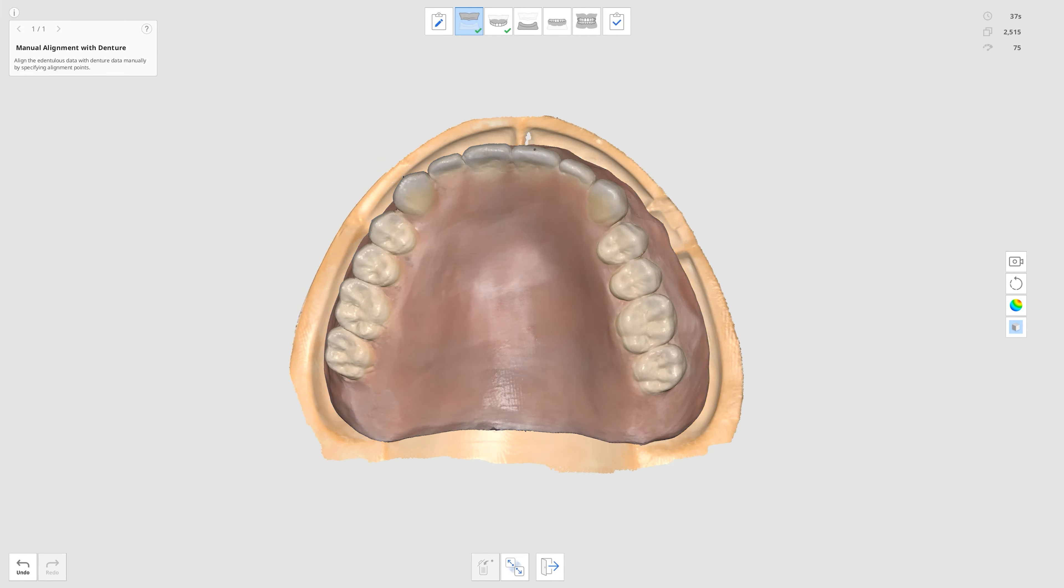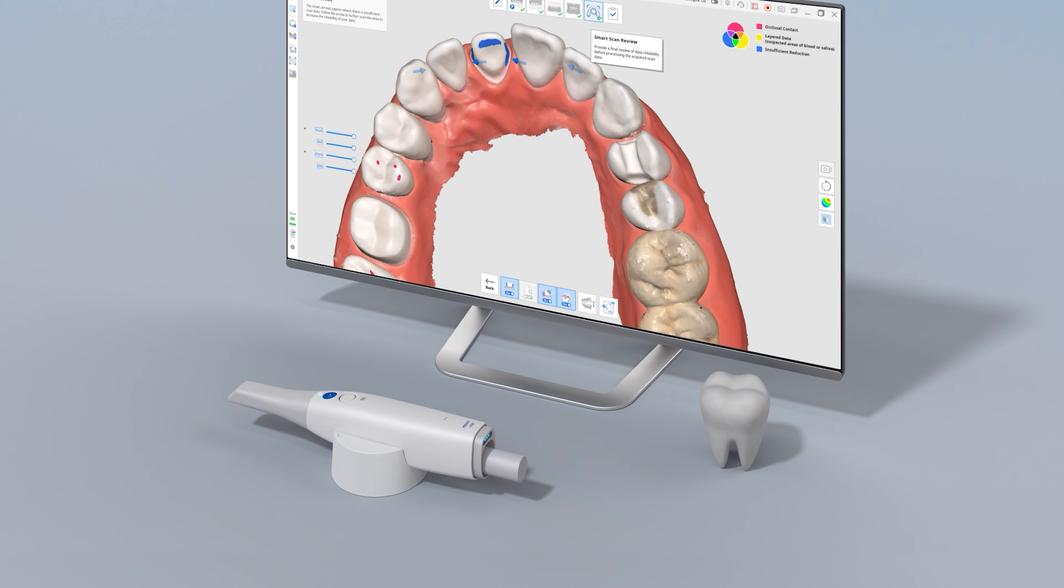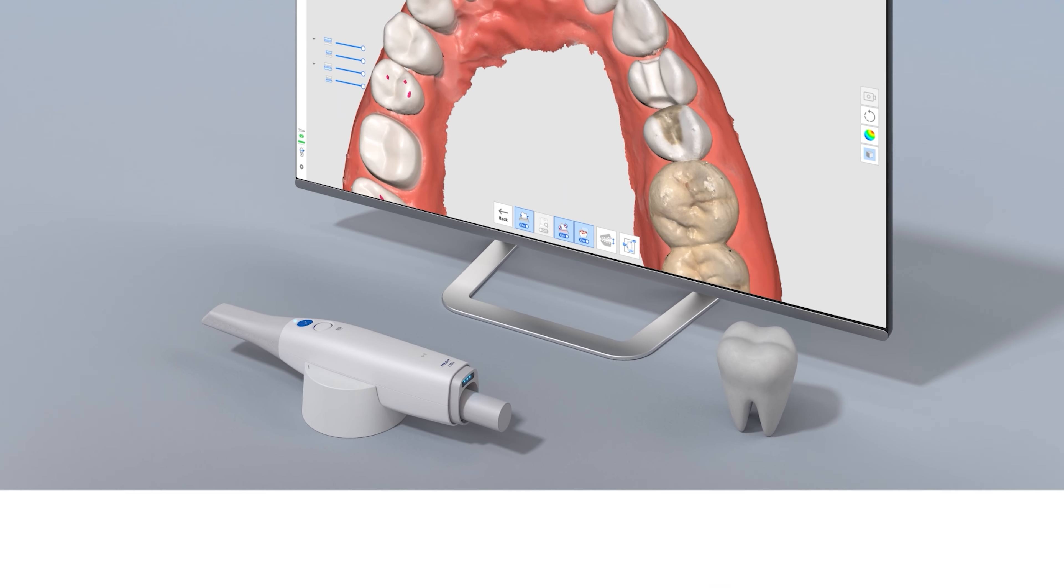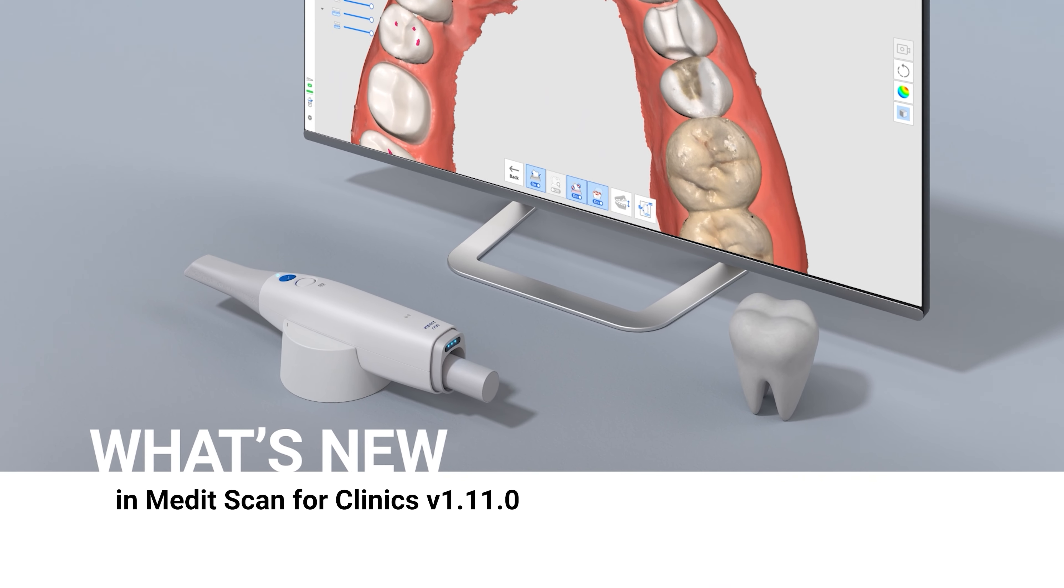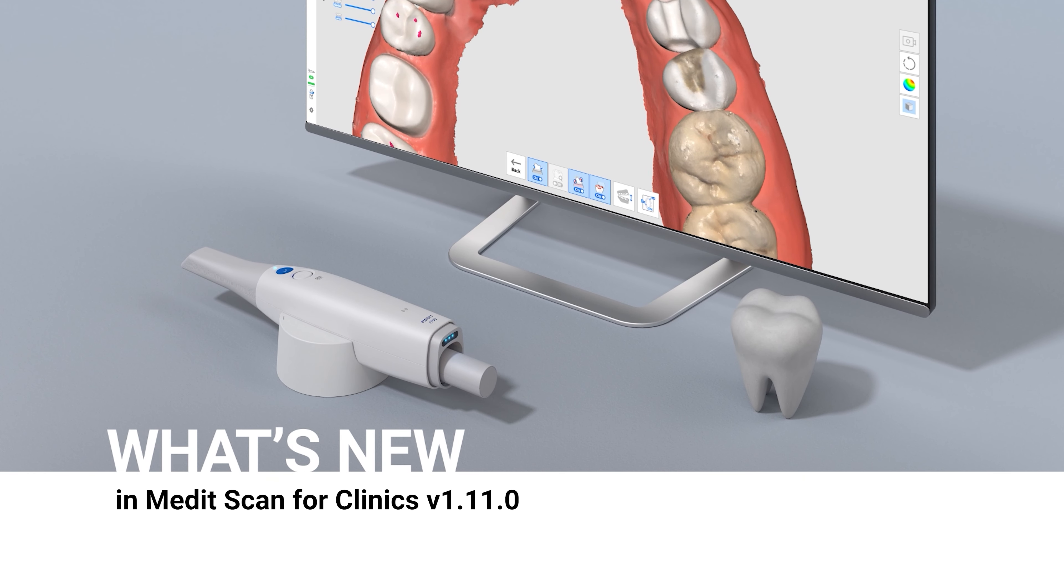This has been an overview of what's been updated in Medit Scan4 Clinics version 1.11.0. Update your software now to check for more updates.